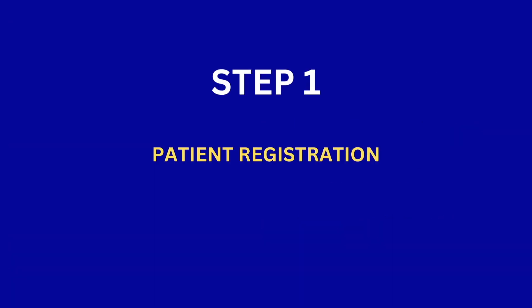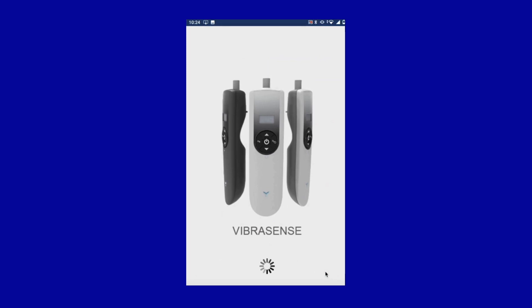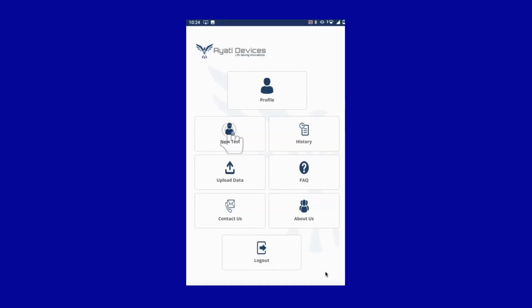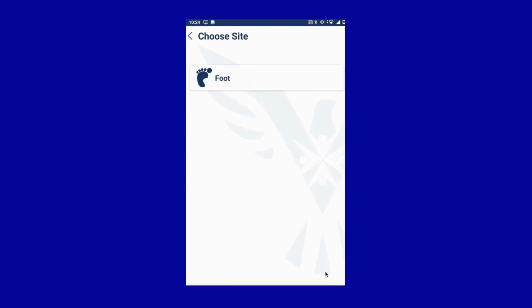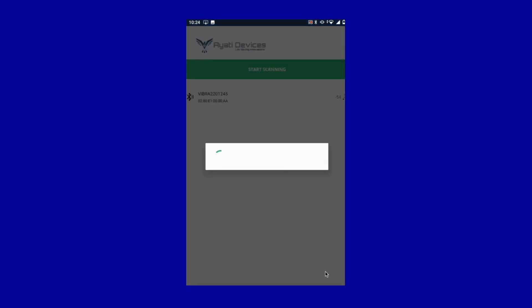Step 1: Registration of the patient. Turn on the Bluetooth, Wi-Fi, and GPS of your mobile. Launch the VíbraConnect app, click on the new test option, and select the foot option. This will bring up the start scanning button — click on this and pair your VíbraSense device when it appears on the screen.